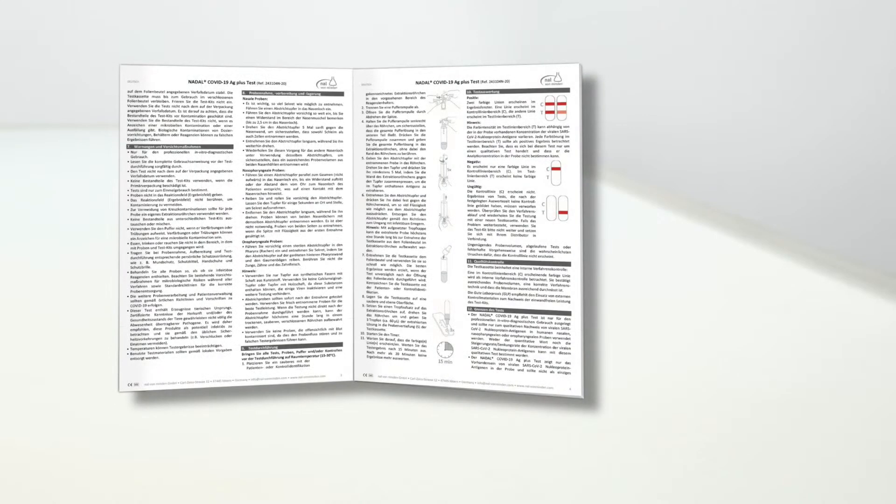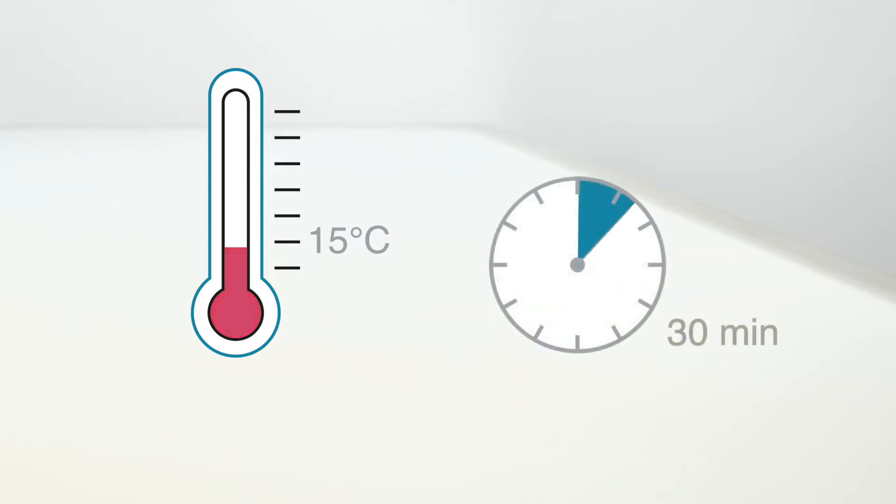Start by reading the instructions carefully. Do not use tests with damaged pouches or beyond the stated expiry date. Use the test immediately after removing it from its pouch and don't touch the result field. Perform the test only at a room temperature of at least 15 degrees Celsius. If stored in a cool place, leave the test components at room temperature for approximately 30 minutes before performing the test.